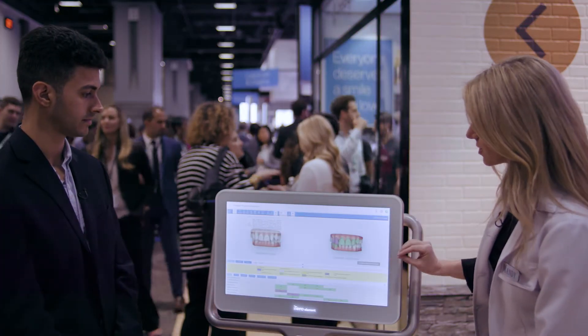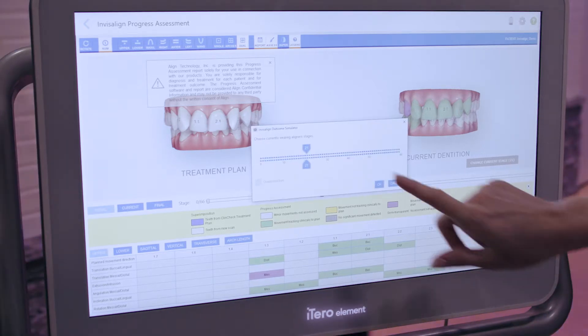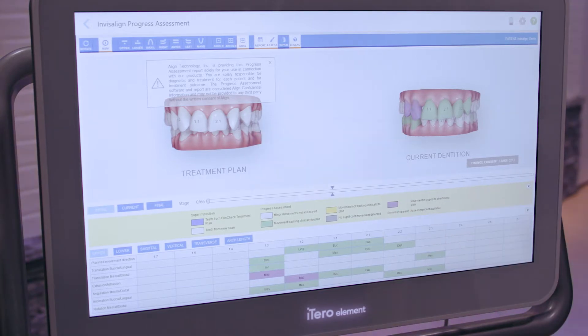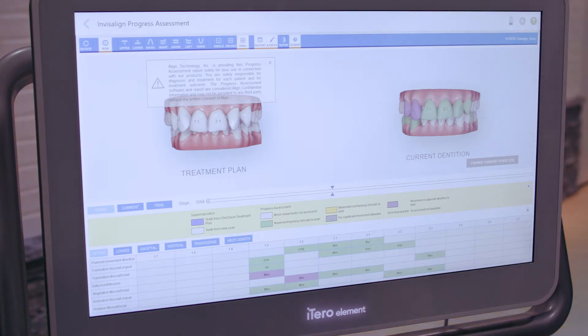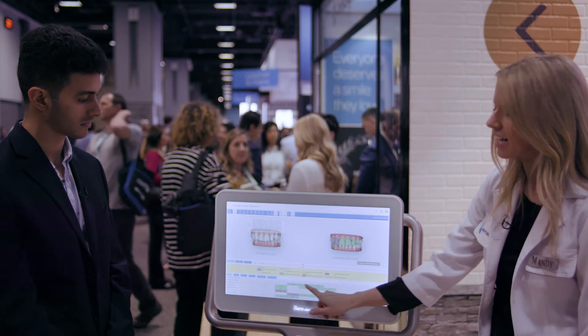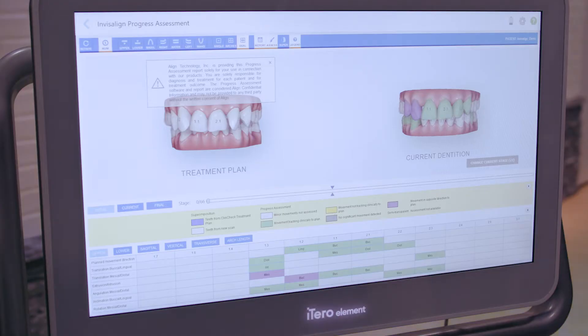I just chose a stage in treatment — you can also change the current stage you're on here, and when you choose what aligner number that patient is in, that's where it gives you the color-coded diagram. The green teeth are tracking as they should be; purple and yellow may not be. You can see exactly what's happening at the bottom, pulling directly from that patient's ClinCheck plan, telling you exactly what's happening throughout treatment — great for patient education.